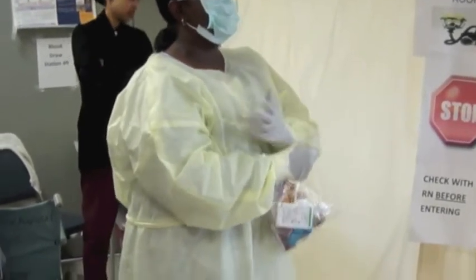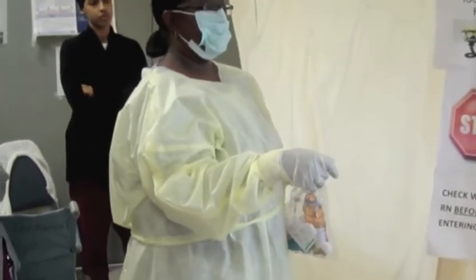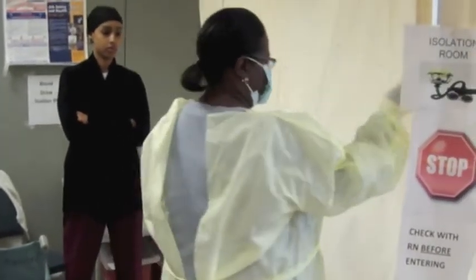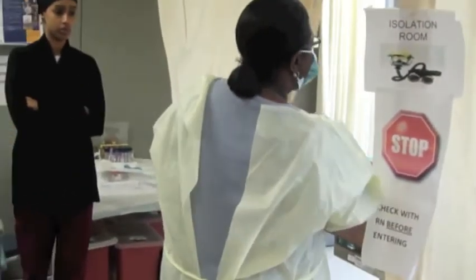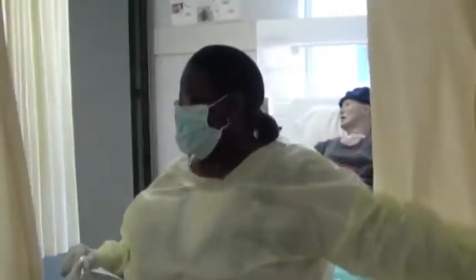Can someone hand me that blood bank form? Thank you. I have to have something to ID my patient with. Hello, I'm here to draw blood from you. My name is Simone. Is that going to be okay? So I'm going to leave it open just so you guys can still see and stuff.